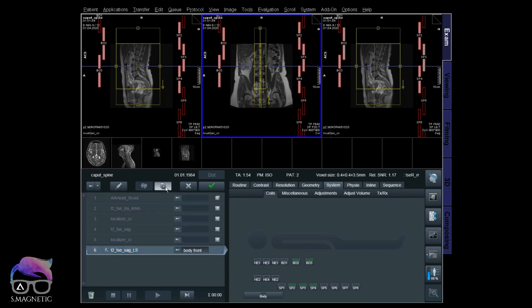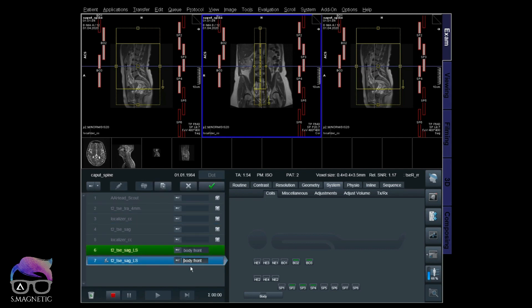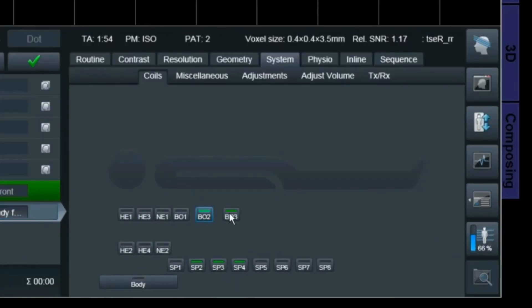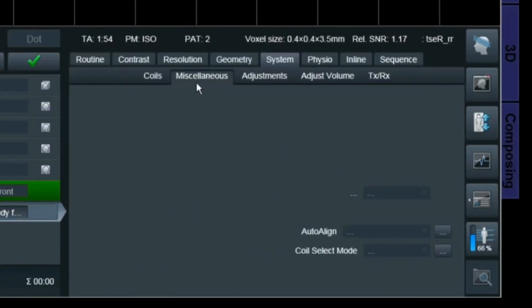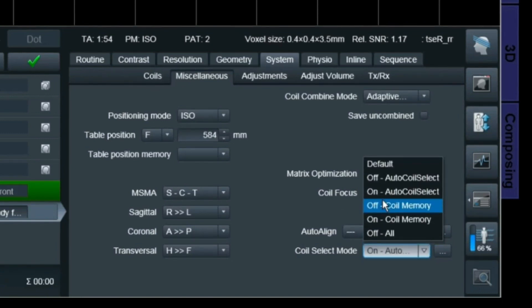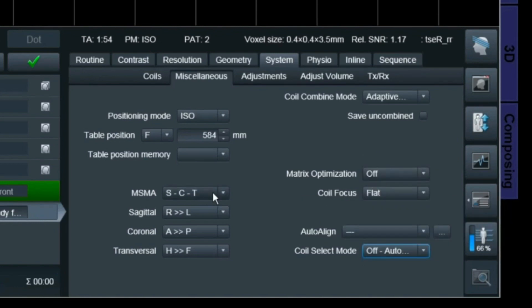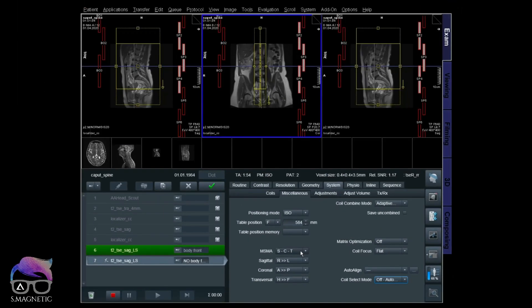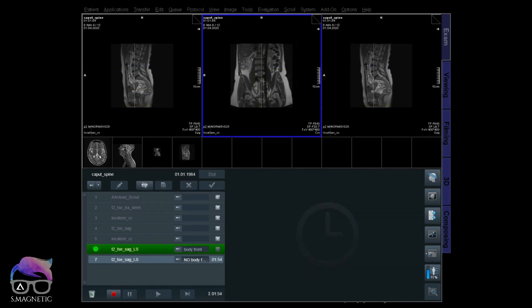Let's scan this one - we'll call it 'body front' to remember the difference. Then we'll use the same sequence but turn off the coils. I'm going into the coil settings and selecting coil select mode, turning off auto coil select - this is to make sure the coil doesn't get reactivated if I move the field of view slightly. We want to keep the scan as identical as possible to compare.